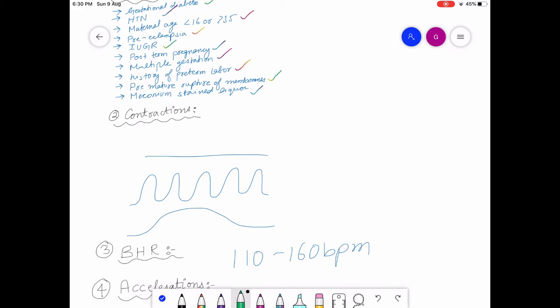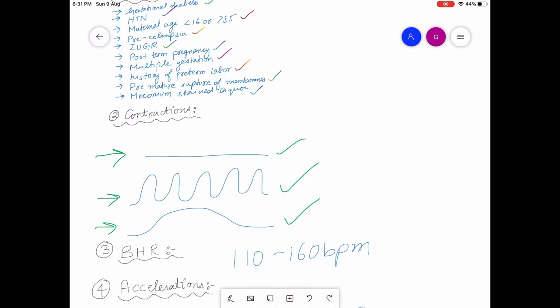Looking at this diagram, there are different types of contractions. We look at uterine contractions to see if the mother is in labor. Initially contractions are less frequent, but as pregnancy progresses, intensity gradually increases. This strip shows no contractions, another with many contractions, and one with fewer contractions.